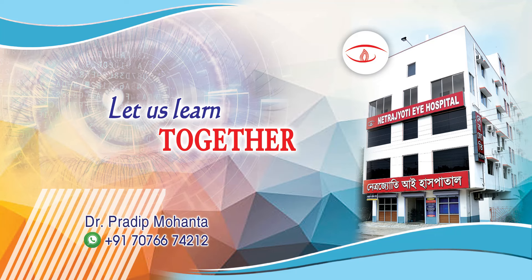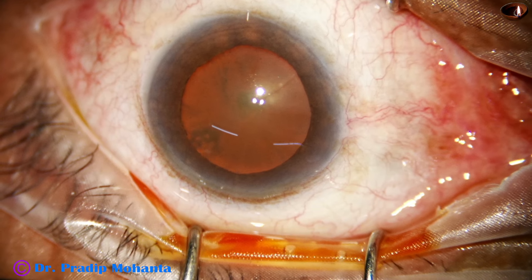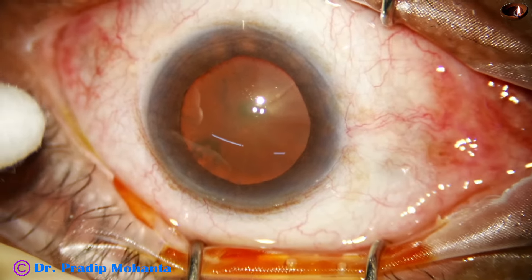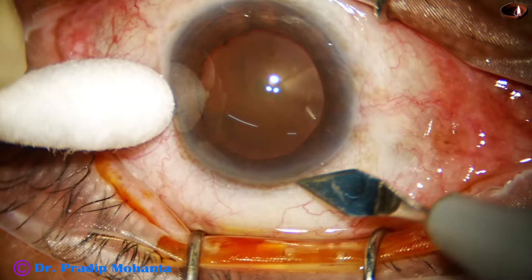Friends, welcome to my workplace at Ranakh Heart, West Bengal, India. This is a hard cataract — nuclear sclerosis grade four — but you can see a very good red glow because of the stereo coaxial illumination of the Lumera T or Lumera I microscope.